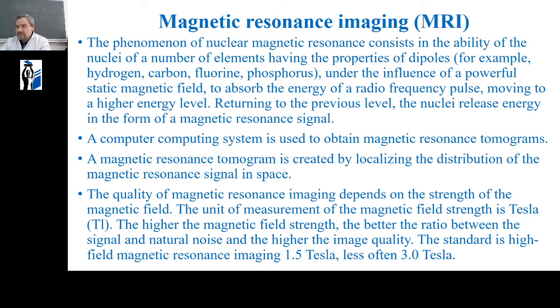Magnetic resonance imaging. The essence of the method requires a separate, careful consideration. The information obtained by magnetic resonance imaging is not density, it is a completely different signal.